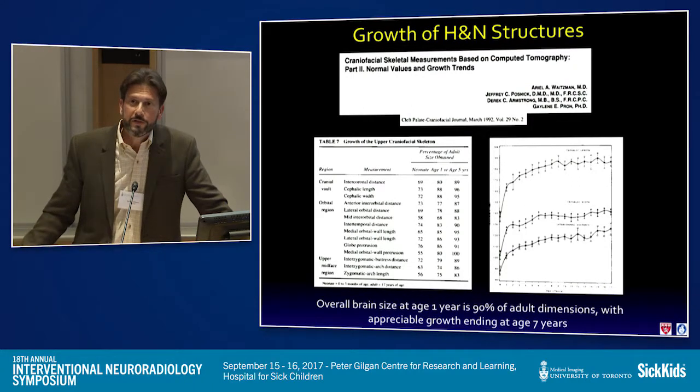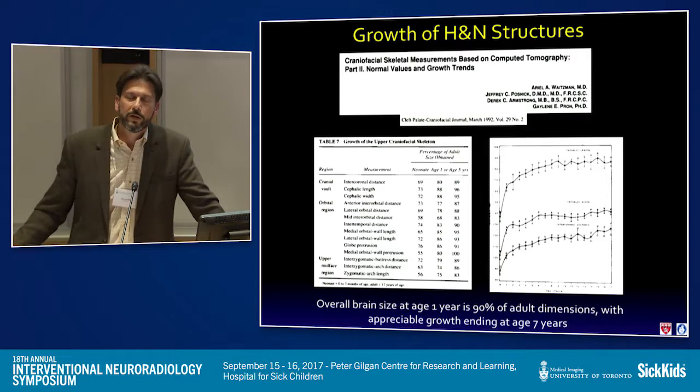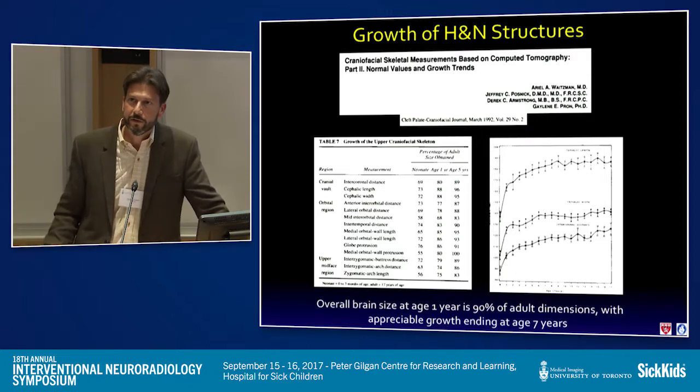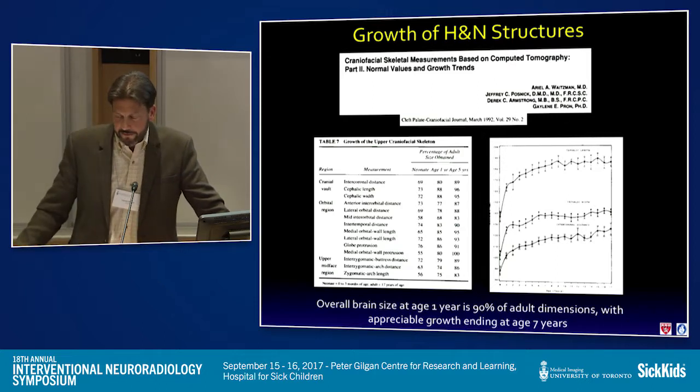Okay, but just a few words about actual technical issues in doing these procedures in children. So one question that comes up a lot is, what about the size of the vessels, and are the devices made for adults usable in children? It turns out the answer is definitely yes, for the most part.